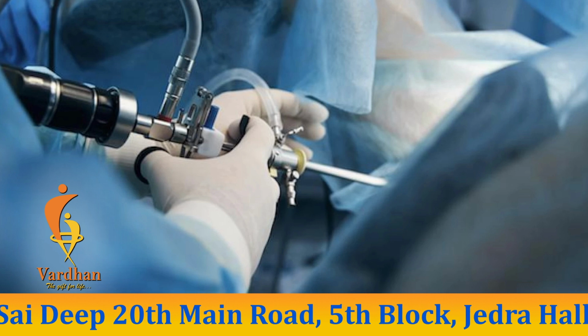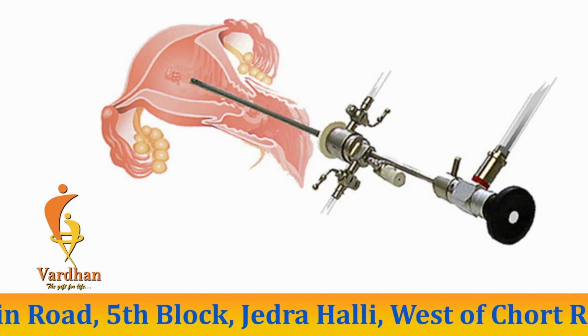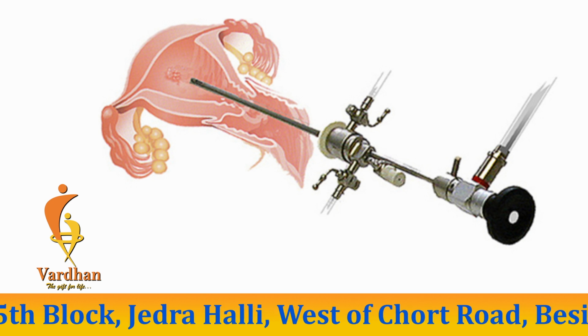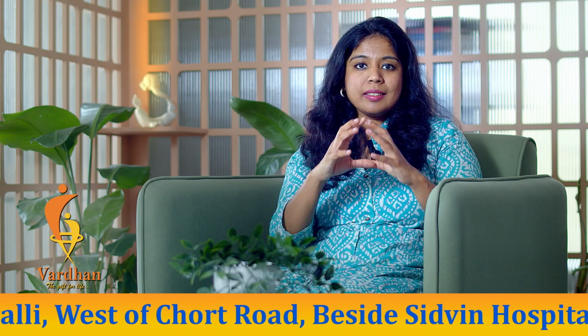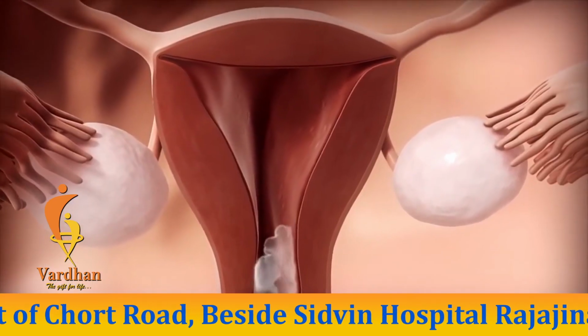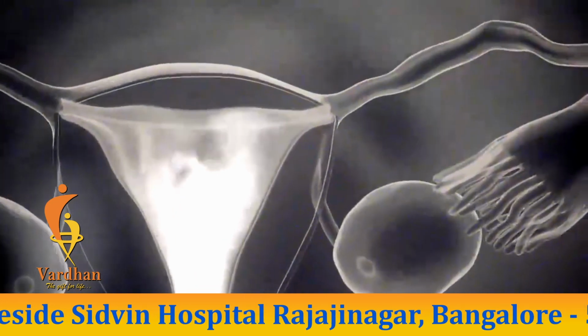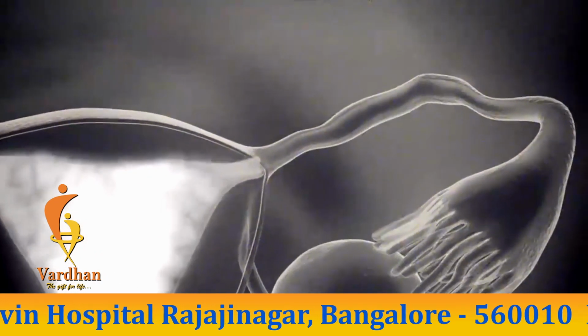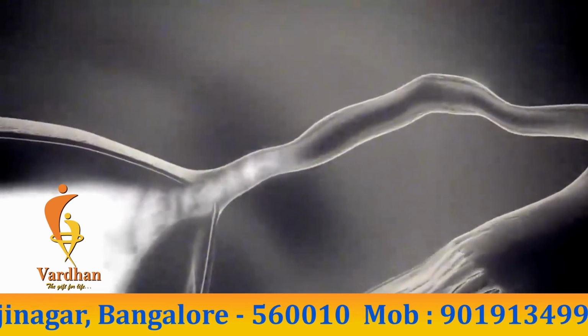During the procedure, we would be inserting a hysteroscope, that is basically a camera kind of instrument, inside the uterus, and usually some fluid is injected into the uterus to distend the cavity of the uterus, and then the images that are taken are seen on the monitor attached to these instruments. We can see the shape of the uterus, and also we can see the ostia, that is the opening of the fallopian tube.